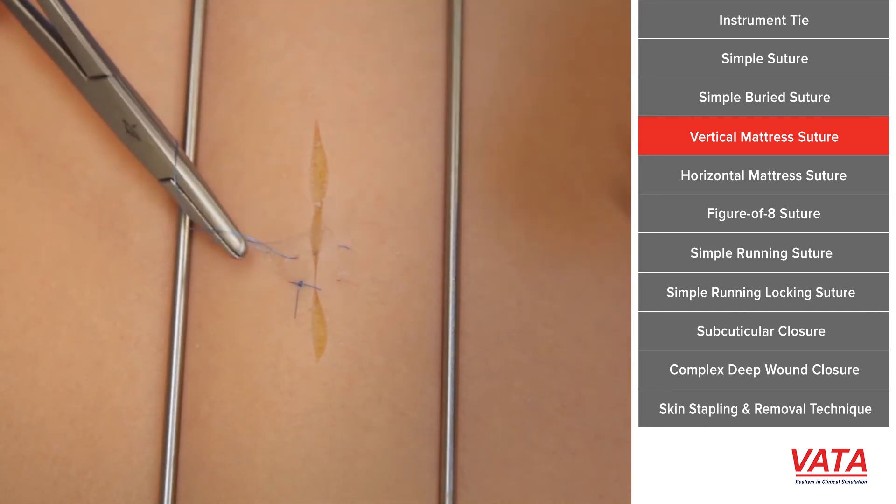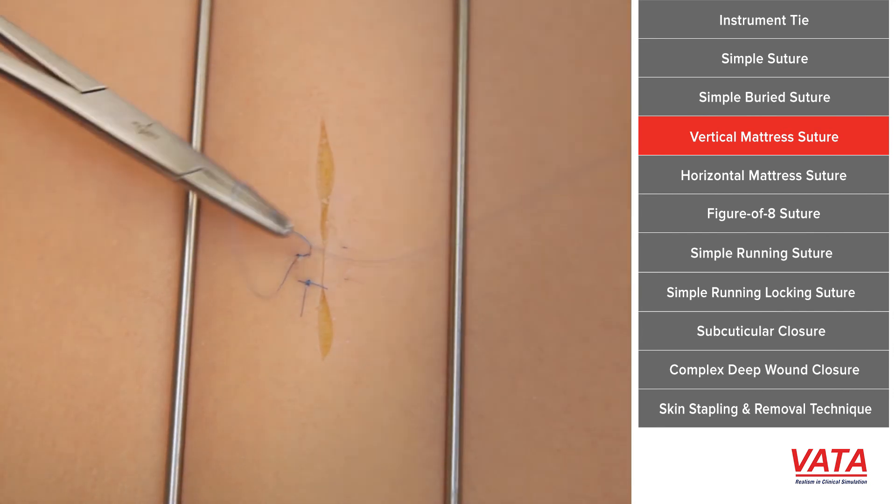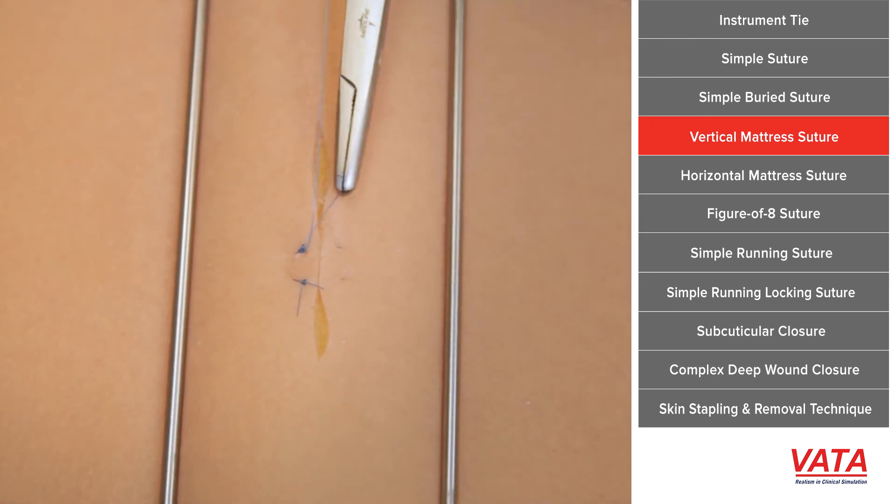This is important when we are doing different types of deeper closures, and certainly wounds that are traumatic and maybe have edema and are swollen and under a lot of tension.